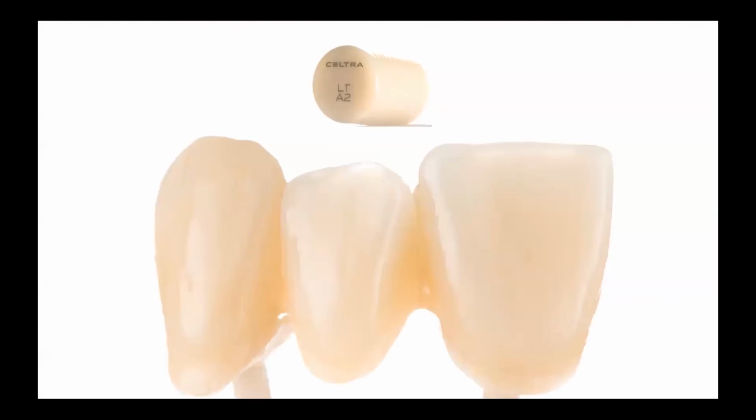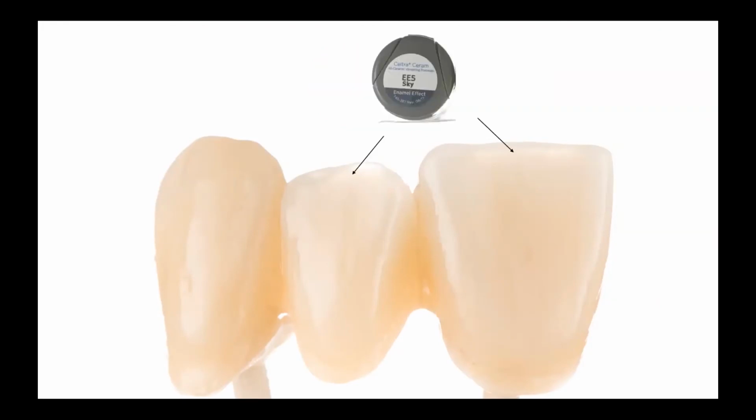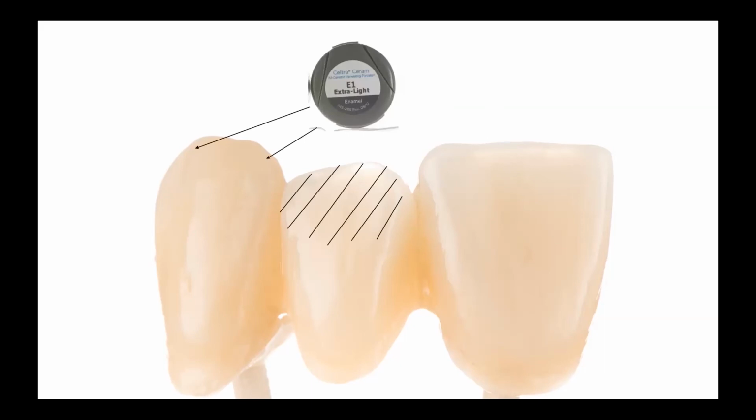And I would like to say a couple of words about a more complicated technique. Have a look, the shade of the ingot was selected according to the shade of the middle part of the lateral of this bridge. After that, the bluish opalescent enamel effect was applied to create the enamel frame, and for distribution of brightness, the light regular enamel was applied on the lateral and a little bit on the corner, on the ridges of the canine.